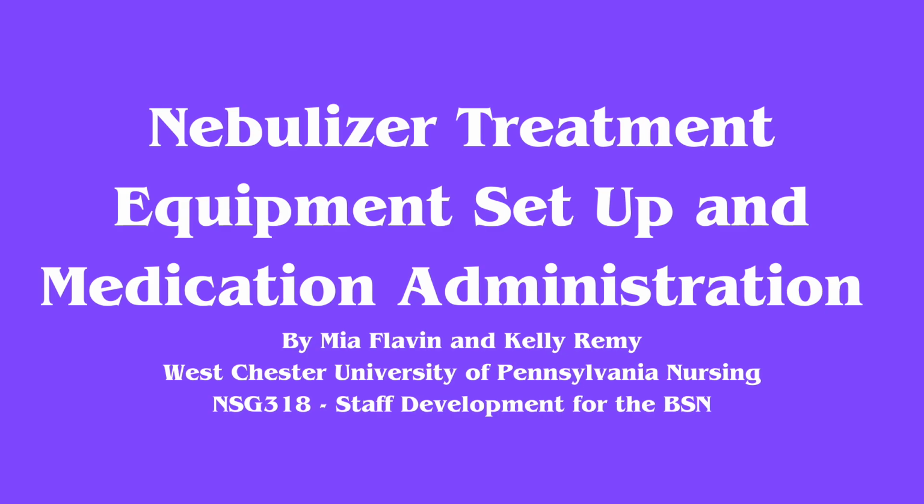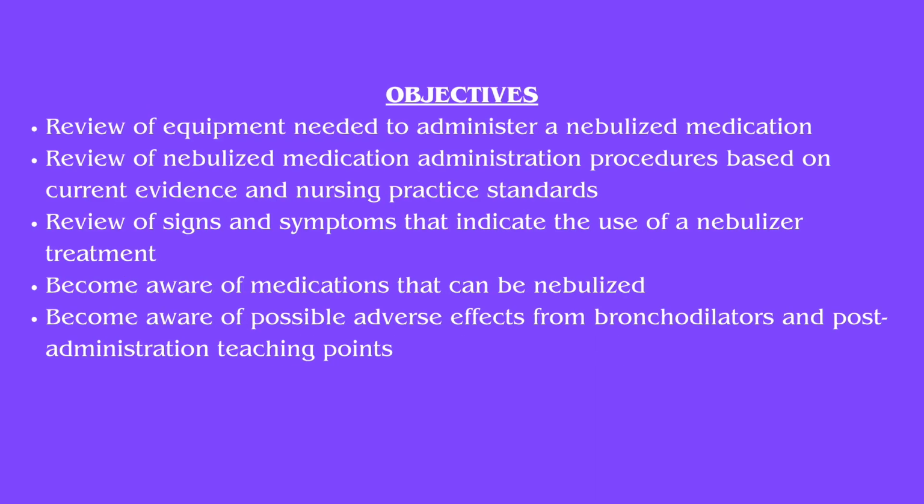Today we will be discussing nebulizer treatments, their equipment setup, and medication administration through this device. Objectives include a review of the equipment needed to administer a nebulized medication, a review of the nebulized medication administration procedures based on current evidence and nursing practice standards, a review of the signs and symptoms that indicate the use of a nebulizer treatment, to become aware of medications that can be nebulized, and to become aware of possible adverse effects from bronchodilators and post-administration patient teaching points.